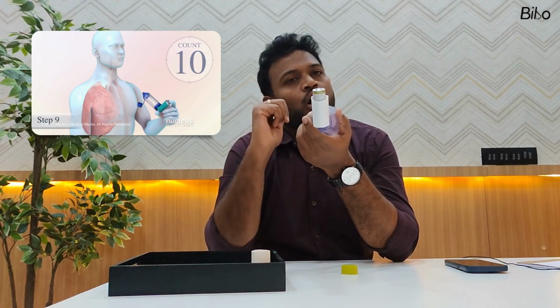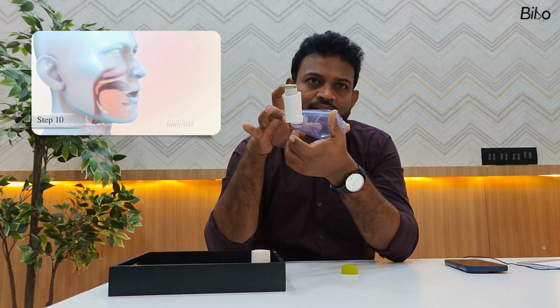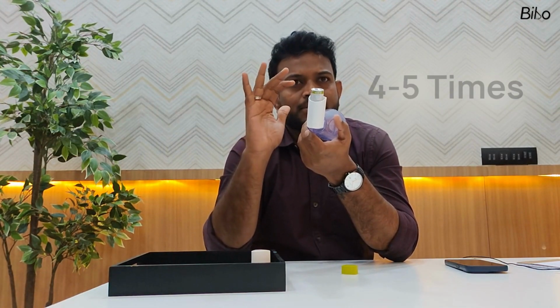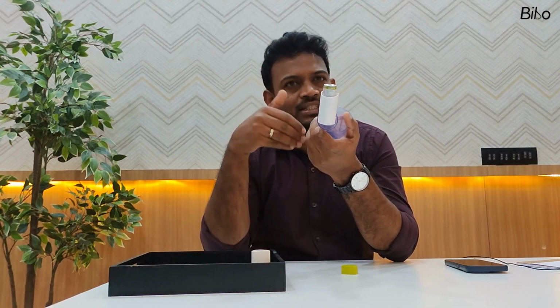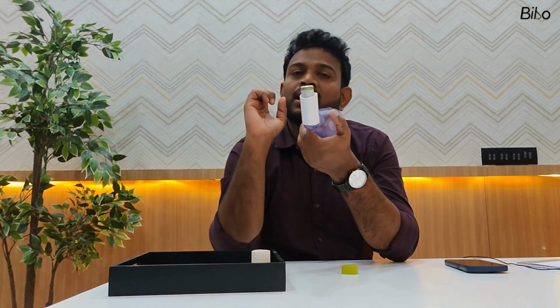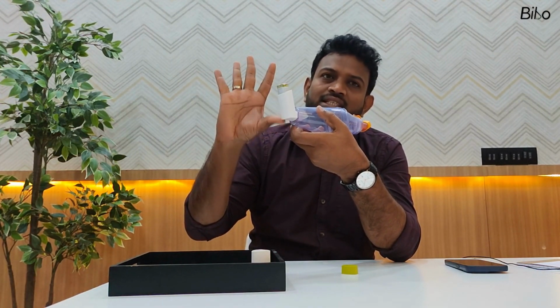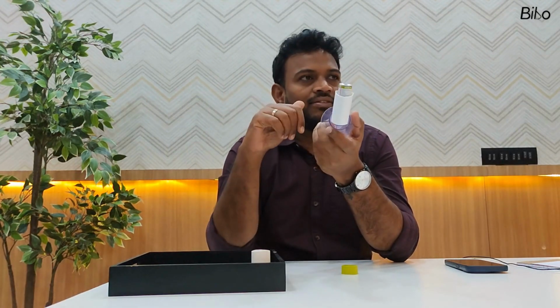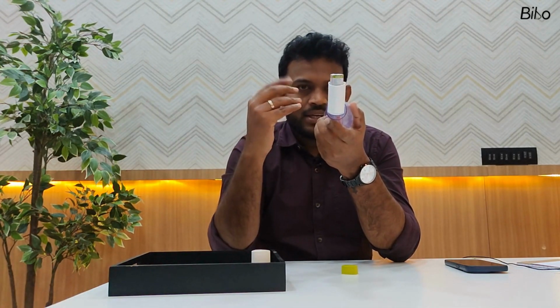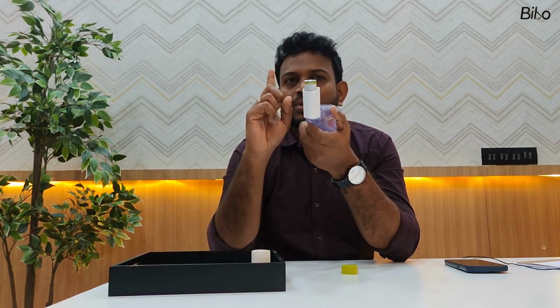Okay, then how many times do we have to do this? Because, as I've told, the drug is suspended in the spacer, so we can take it as many as 4 to 5 times. Every time it is the same: we have only one puff, the doctor has advised only one puff. Remember, one puff means we have to press once. So this is one puff, done. Then we have to inhale, hold, and then exhale. That is one cycle. Again, we don't have to press because the doctor has advised only one puff.